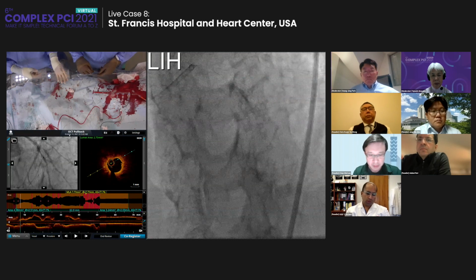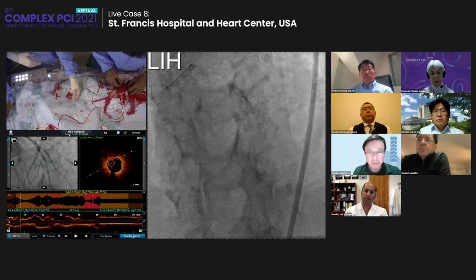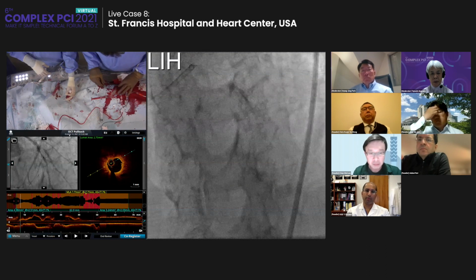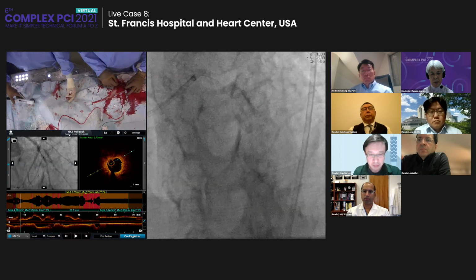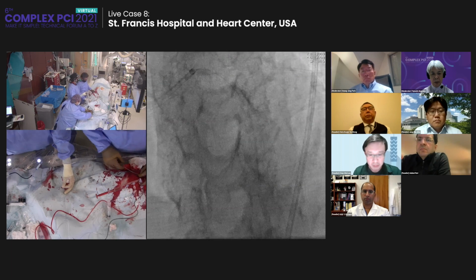And the other thing too, that folks will do, and we sort of do it routinely, is even after we see the fracture, I'd be curious, Rich, to hear, do you just put stents in at that point, or do you take an NC balloon and try to make sure it's dilated? So I personally just put a stent in. I know some of my colleagues will balloon it. I love when I have fracture to have a stent in to protect me before I go high pressure.